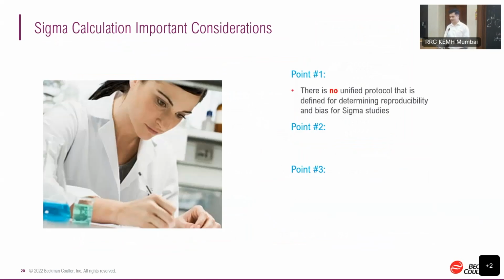Some important considerations: there is no unified protocol defined for determining reproducibility or bias for the sigma study.